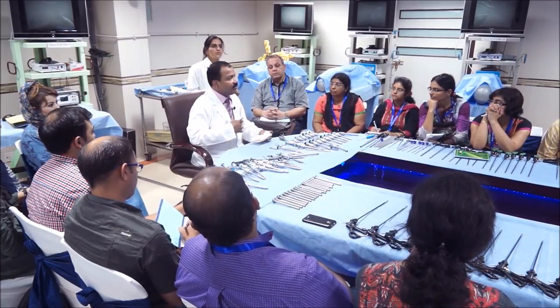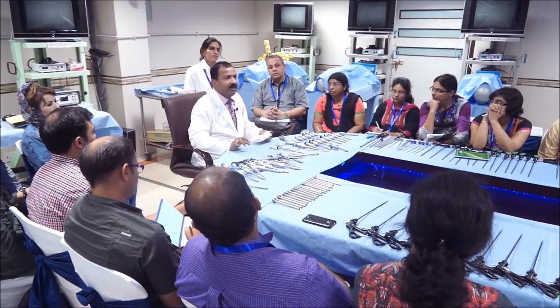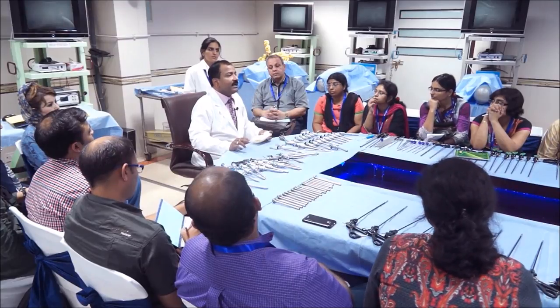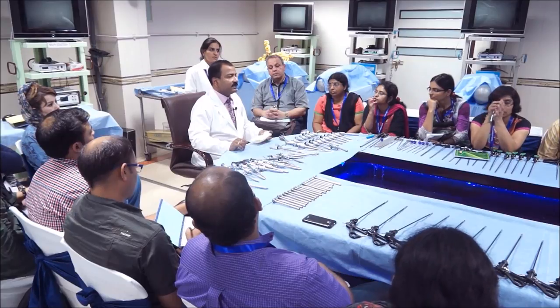Otherwise, in the Palmer's point or in supraumbilical, you will never go oblique, isn't it? But 90% of the surgery is done going through the umbilicus. The umbilicus is the most attractive site for the primary trocar insertion.